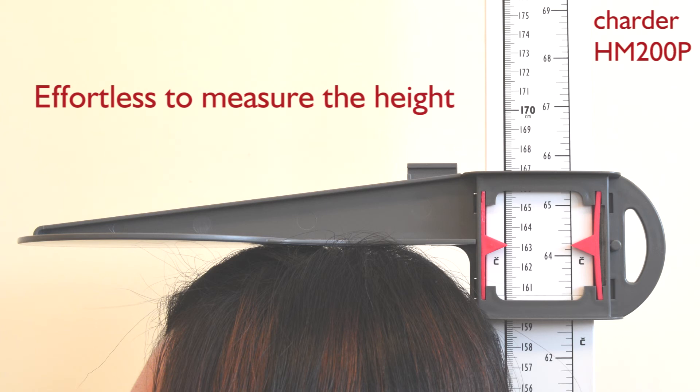Reading height result from red arrow direction. Measurement is easy and completed.